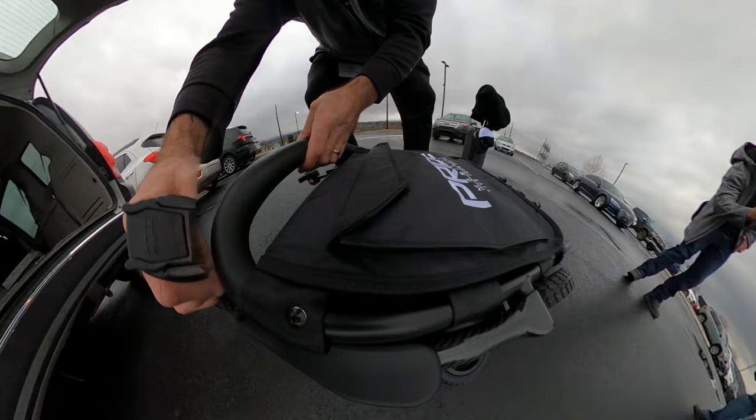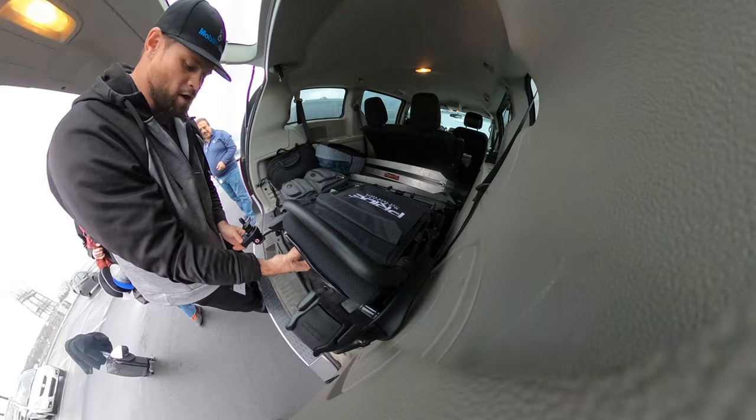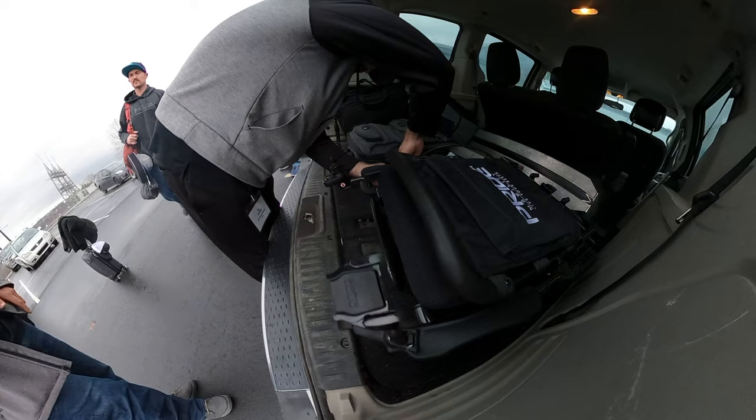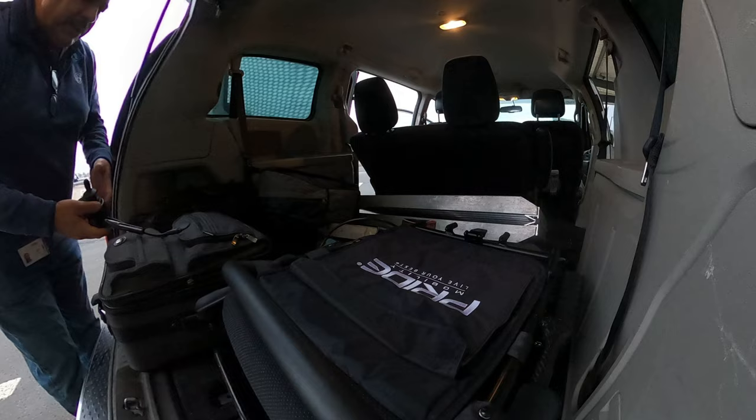So that's really cool. Good idea. Just put it right in. And it's probably better that we turn off the joystick and probably even remove it. So I don't want to damage this, so I'm going to remove it. Oh, you already took, you did take it off. All right, yes, I did. Oh, I didn't know you did that, okay. Thank you, sir.